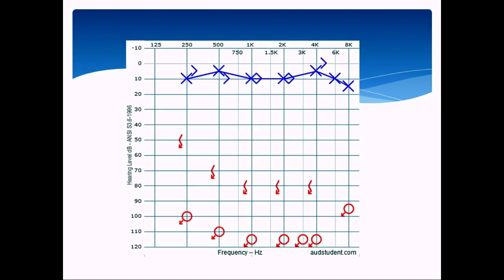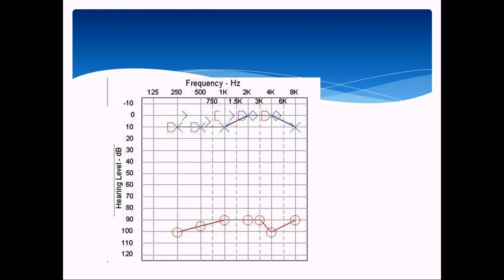And it's important for several reasons, which we'll talk about in a minute. So here's another audiogram. Again, let's assume the bone symbols correspond to what side of the head you put it on. So look at this audiogram, and a couple of things should jump out at you.